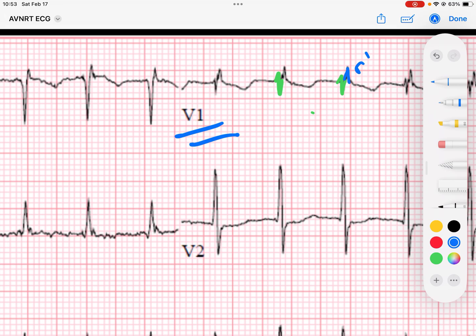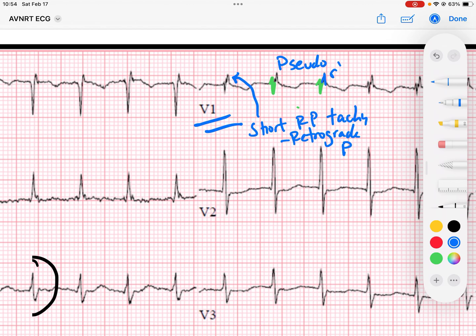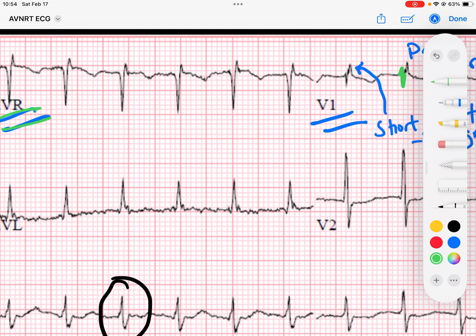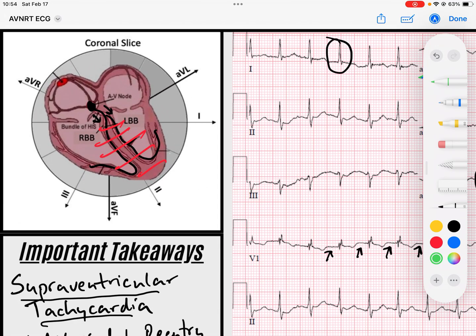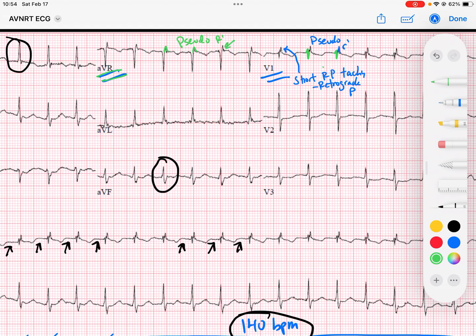And that R prime, we're like, well, is this an incomplete right bundle branch block? Well, in the setting of a narrow complex tachycardia with no P waves, we call this a pseudo R prime. What is that R prime? That's actually representing, this R prime is actually representing the short RP tachycardia, right? That is the retrograde P wave. And you can see that even better in AVR, where we have that pseudo R prime, right? That R prime is heading towards AVR at the end of the QRS. Well, if we had retrograde depolarization from this AVNRT going in this direction via the atria, we would have a retrograde P wave that would be upright in AVR. And that's exactly what we're seeing here. So that's our pseudo R prime.